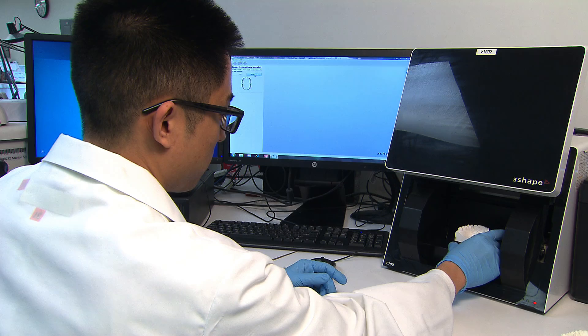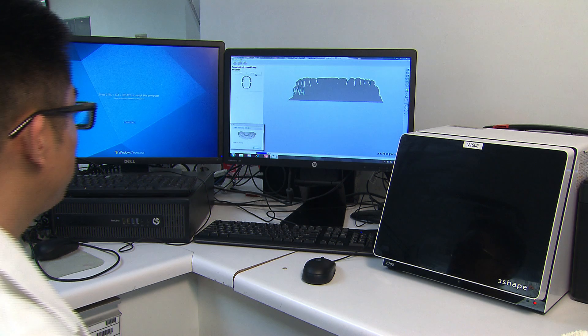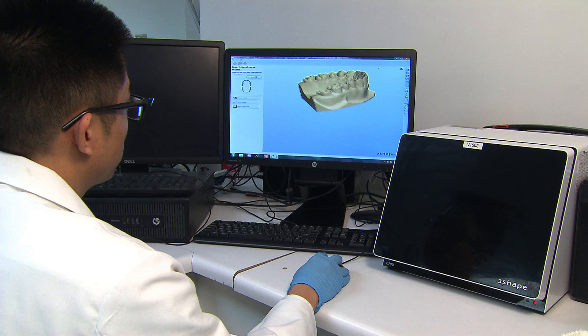There they take a scan of the upper and lower arch of the master model using the 3Shape D700. After the scanner drops the STL files onto a local computer, the digital portion of the process for a first-time prescription is complete.